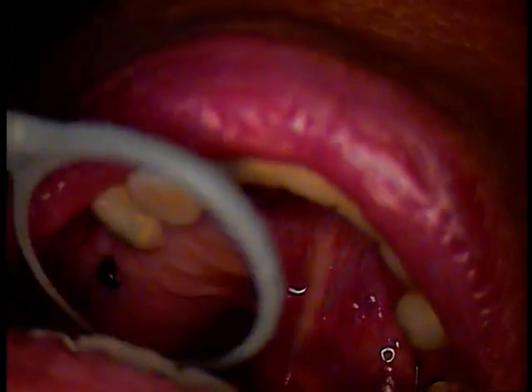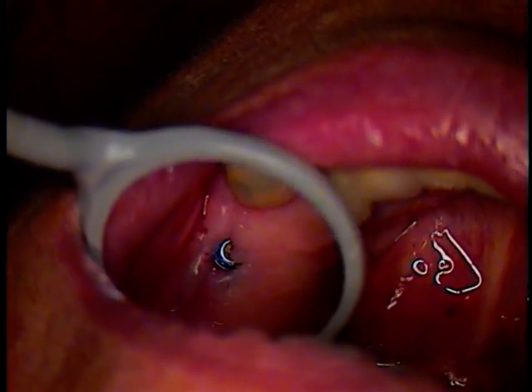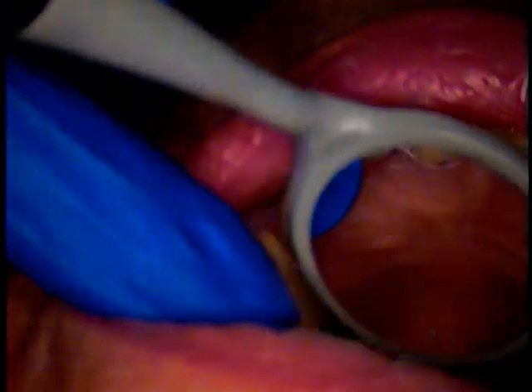Hello and welcome. This is Dr. Jerry Como. I'm here with another rescue case. This one is the keystone referred by a local dentist.